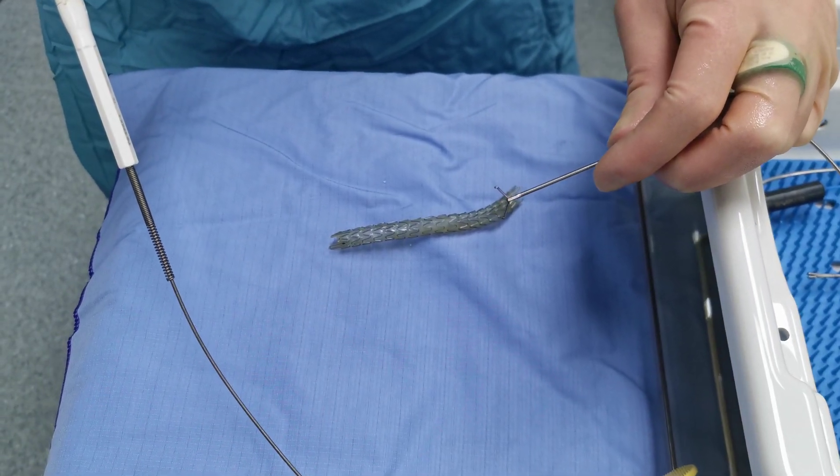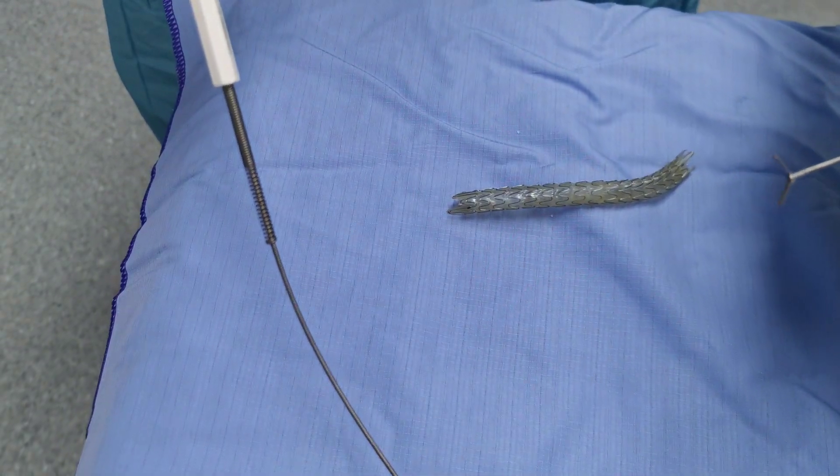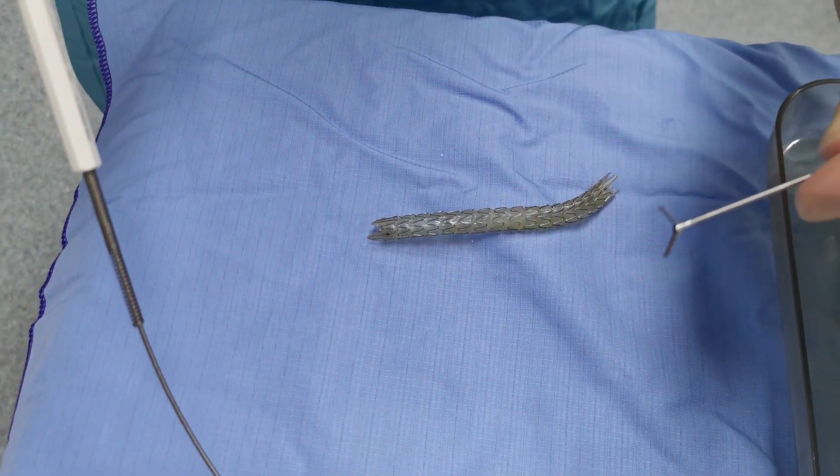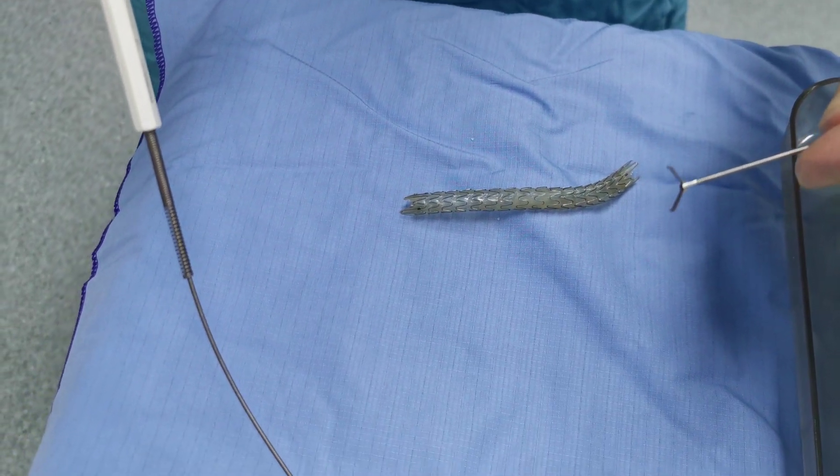This is an Allium stent that we just removed from a patient's bladder. It had migrated down into the bladder and we've replaced it with a longer Allium stent. We want to show you how they're constructed and how you remove them.